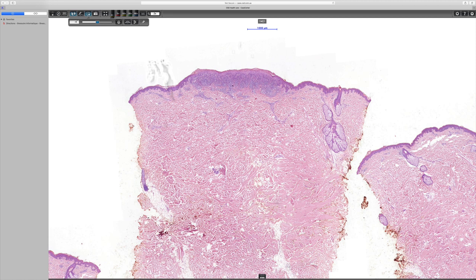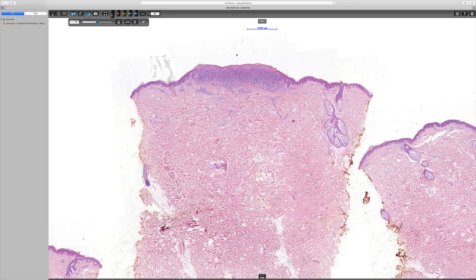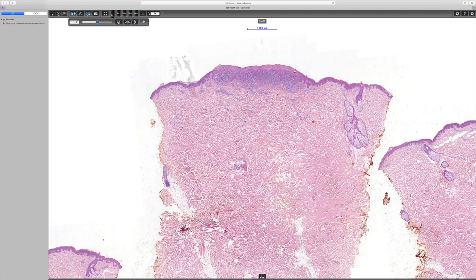Lichen striatus could show similar morphology, although generally one expects to see spongiotic change as well. In any event, lichen striatus presents with multiple lesions in a linear distribution following a dermatome, so it can be excluded. Nikam's disease is another possibility, but in Nikam's disease one tends to see multiple lesions, often in reticulate or plaque form, so that can be excluded. Similarly, a lichenoid drug reaction doesn't usually present as a single lesion.